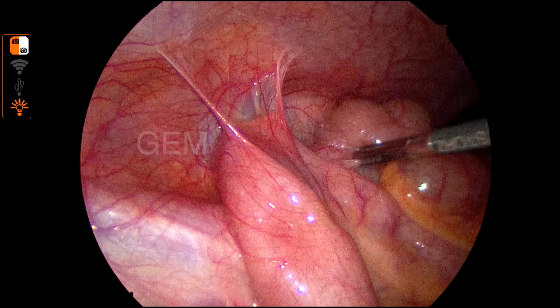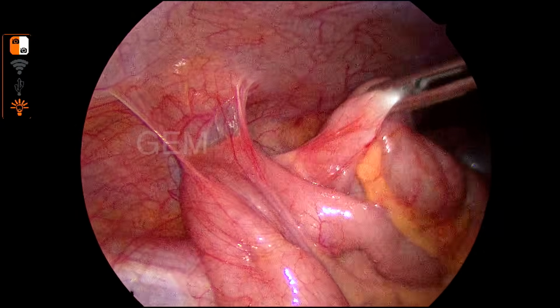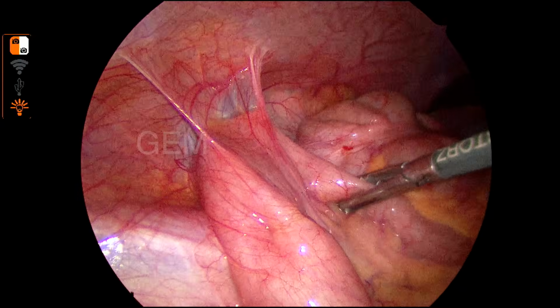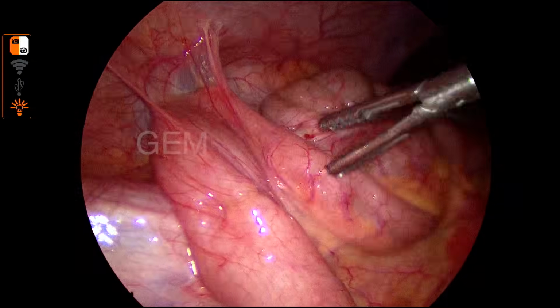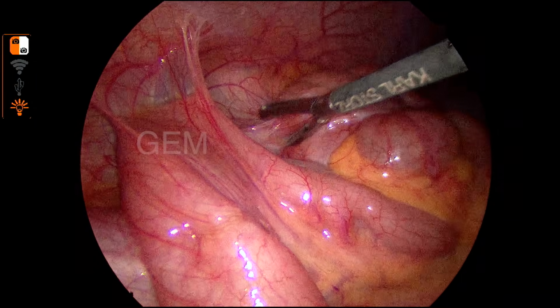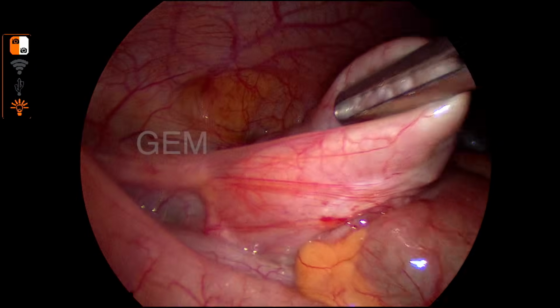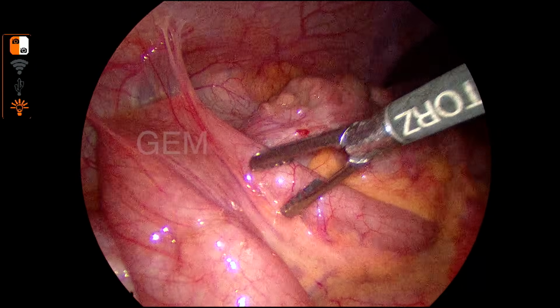So he is searching for the appendix. Usually I don't hold the cecum or colon with any instrument, because that is not our aim. Even if you hold the small bowel, no problem. If you see my videos, I will not hold the cecum. So always try to not hold the cecum. If you want to hold the cecum, you can hold it at the tinea level. That is a little bit stronger.